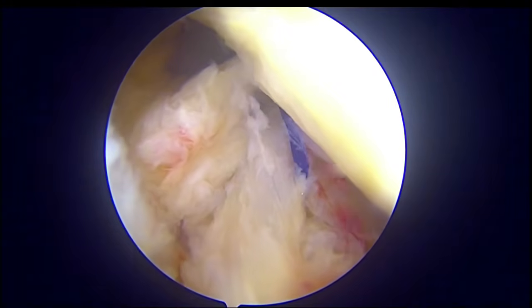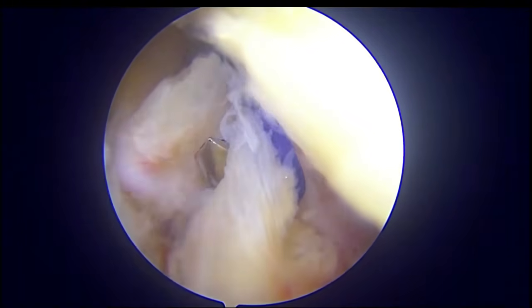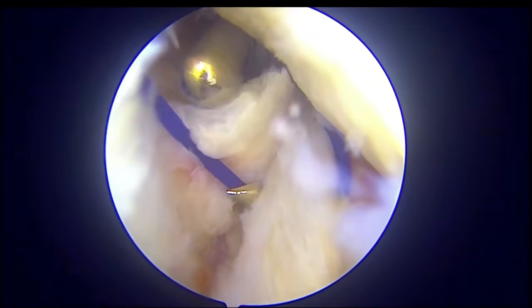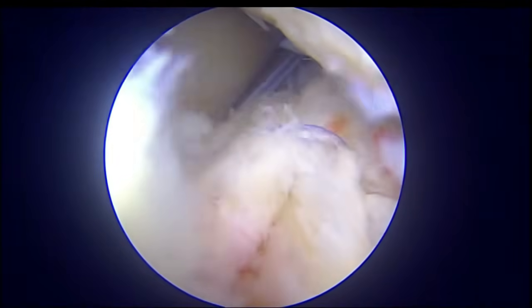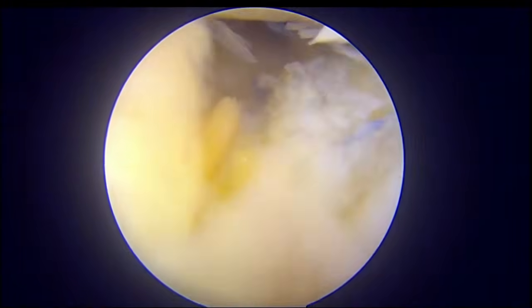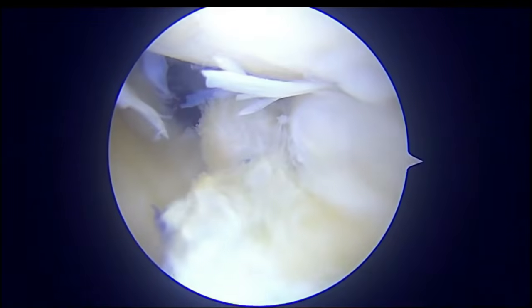And now again I am using the lasso to take the bite from the posterior part of the meniscus. So the lasso is passed through the meniscus. Prolene suture is coming out and it is being grasped by a grasper. And now the fiber wire is coming inside and the knots are being put. So now you can see that three sutures have been put, and it is a very good construct.